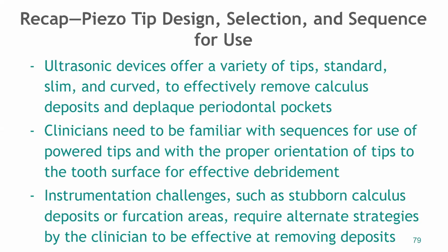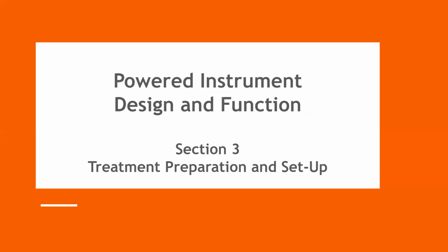Ultrasonic devices offer a variety of tips. We have standard, slim, and curved to effectively remove calculus deposits and deplaque periodontal pockets. Clinicians need to be familiar with the sequence for use of powered tips with the proper orientation of tips to the tooth surface for effective debridement. Instrumentation challenges such as stubborn calculus deposits or furcation areas require alternate strategies by the clinician to be effective at removing calculus.